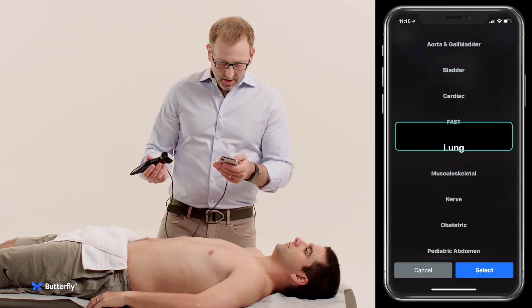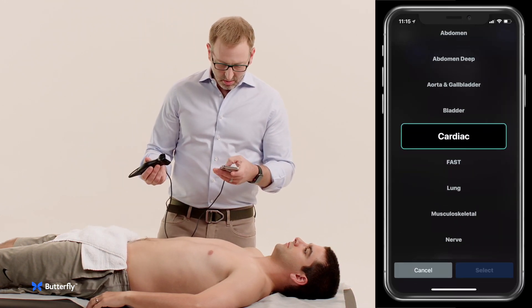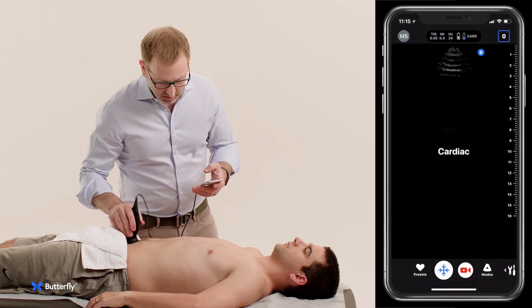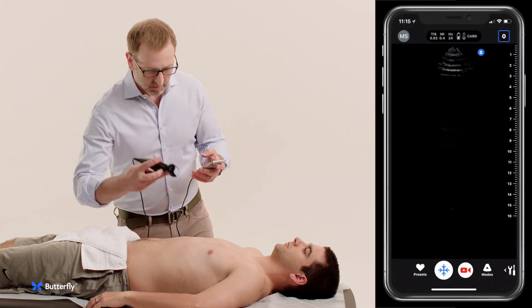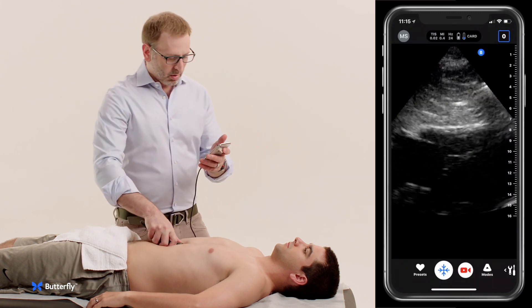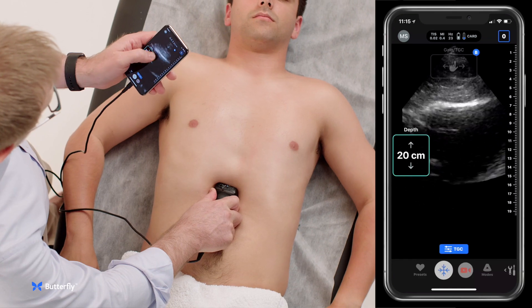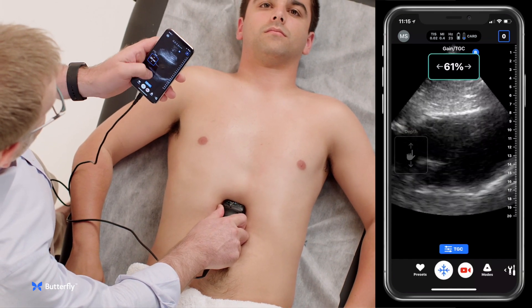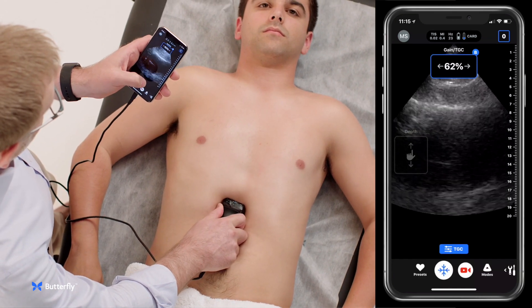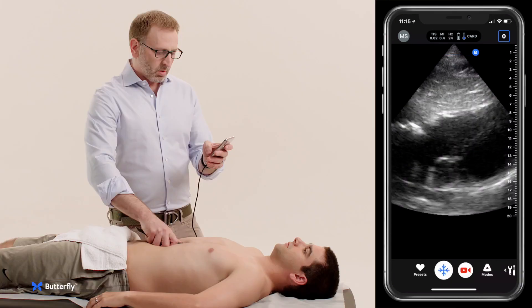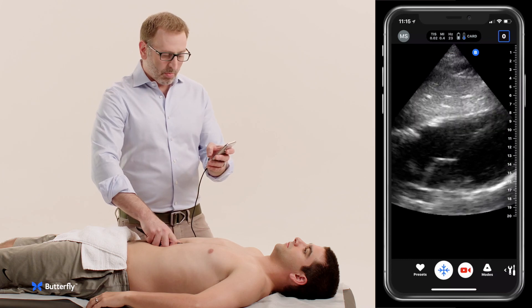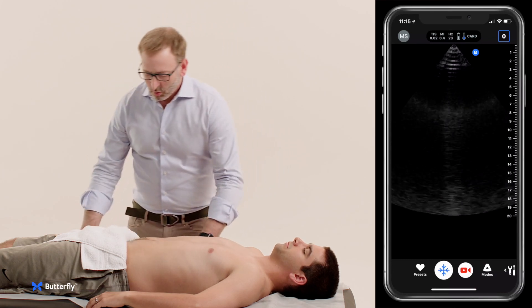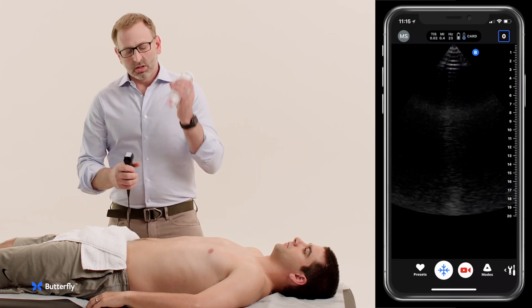We'll then switch to a cardiac preset and take a look from a subcostal window, looking for any fluid around the heart. Finding no pericardial fluid, we move on and take a look at the lungs.